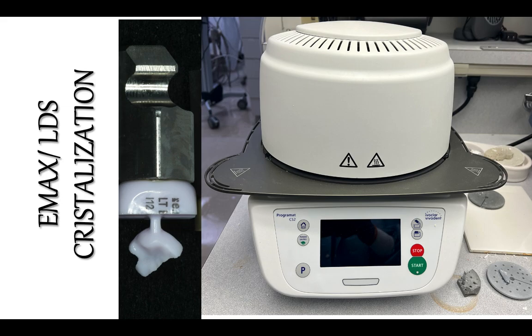And if it's thin, it can also crack. So it's good that we try to have a better temperature in the lab that is not too cold, or if we are going to let it slowly cool down, we try to place it in these areas so that it slowly cools down. And then you remove the fire support that looks like cotton, and then you place it in the ultrasonic bath to clean it out.